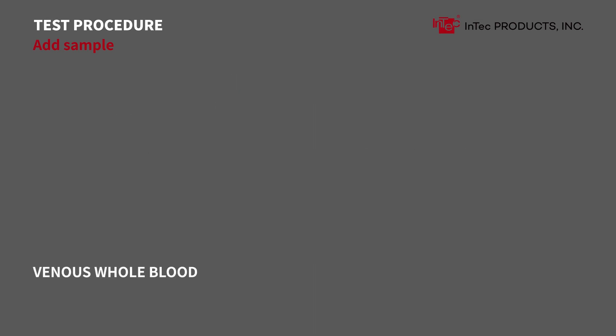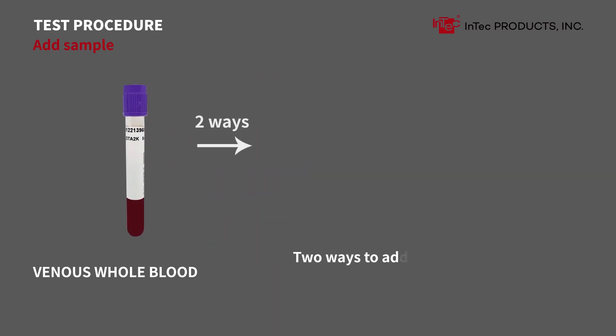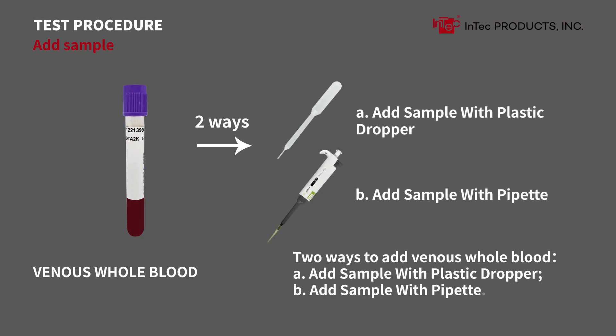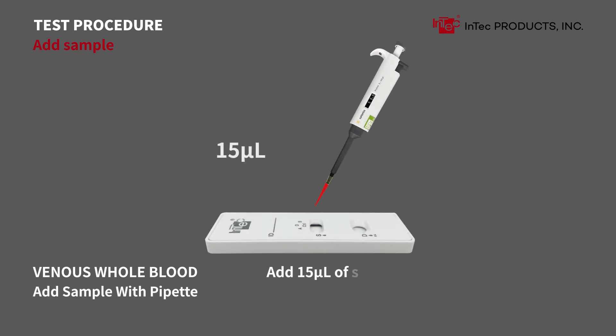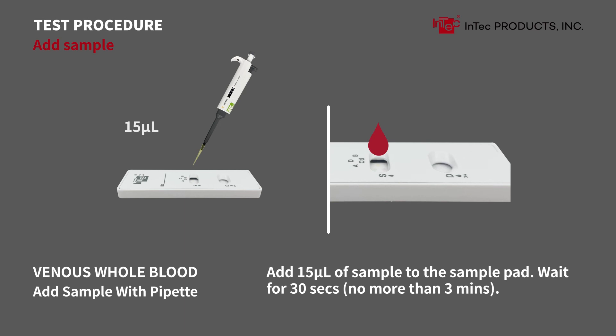For venous whole blood, stratified samples should be turned upside down 3 times prior to use and fully mixed. There are two ways to add venous whole blood: A) Add sample with plastic dropper, or B) Add sample with pipette — add 15 microliters of sample to the sample pad. Wait 30 seconds, no more than 3 minutes.